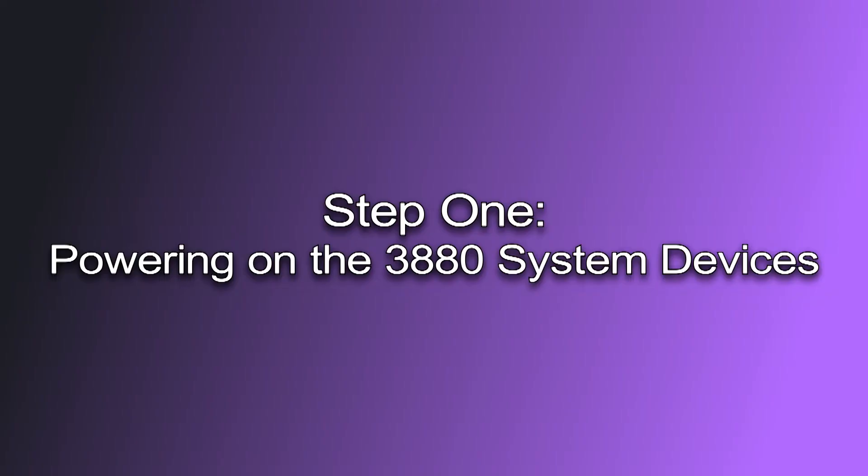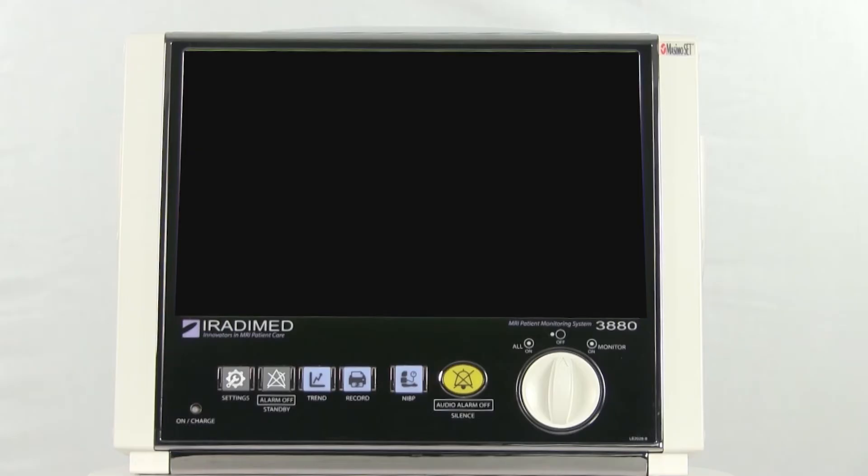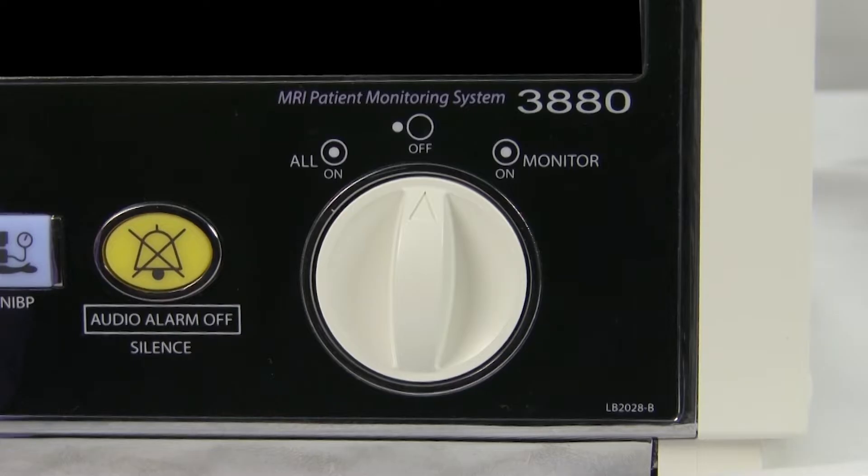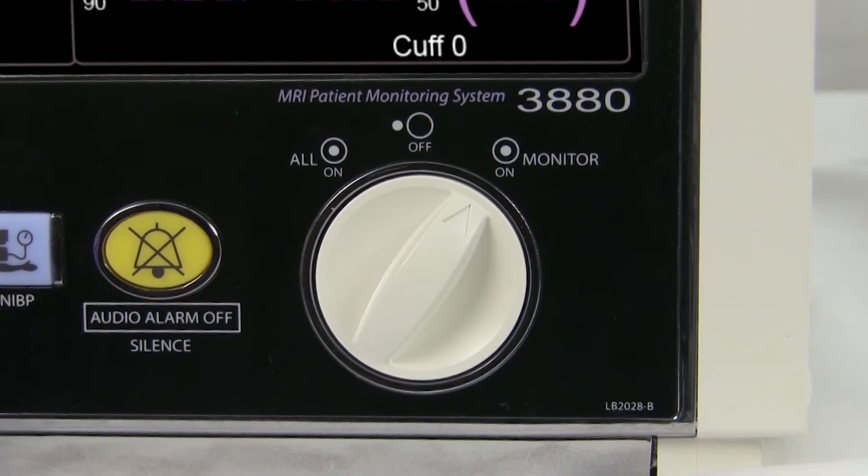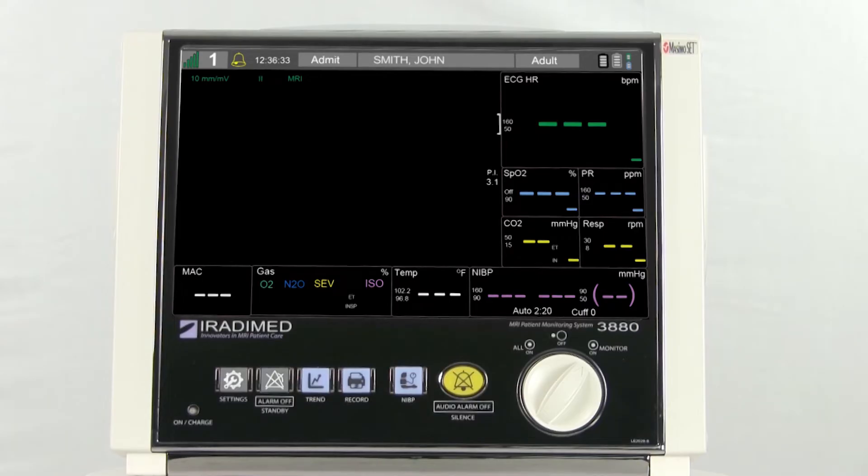Step 1: Powering on the 3880 system devices. To power on the 3880 monitor, the user will gently grip the white knob that is located on the bottom right corner and turn the knob one click to the right to the monitor on position. The device will then power on instantly.